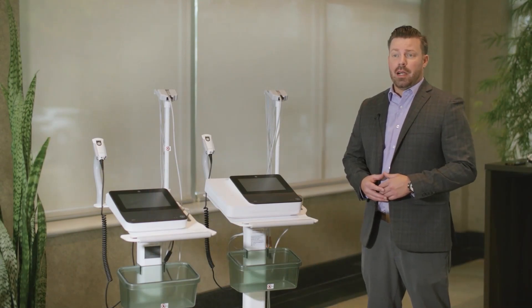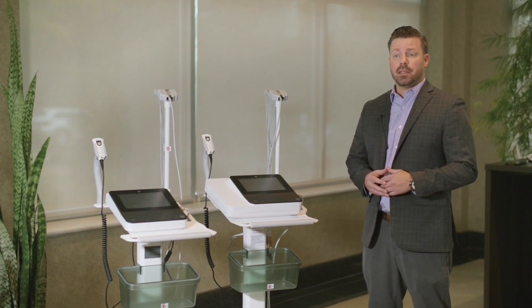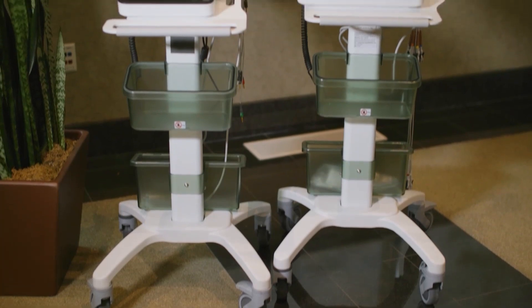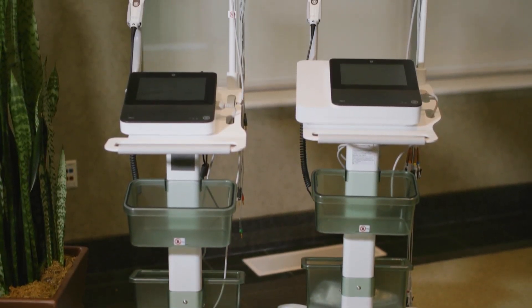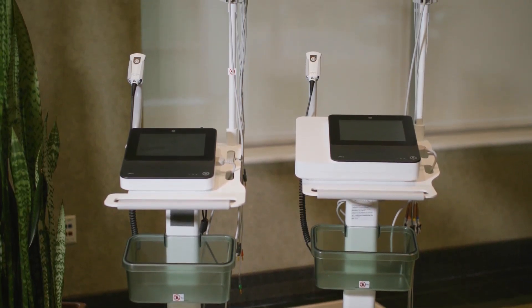Utilizing our patented Marquette 12SL algorithm, the MAC-5 provides the same clinical excellence you have come to depend on in our ECG management devices and systems for the past 30 years. In this introduction video, we'll take a closer look at the MAC-5 and its operating system. Please take a moment to review the full operator's manual that came with your system prior to utilizing the device.